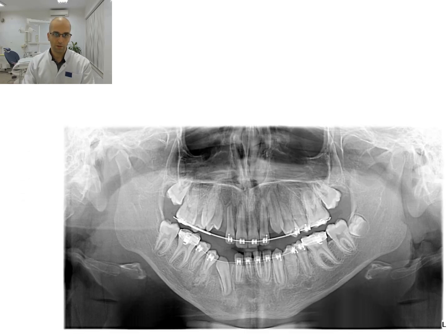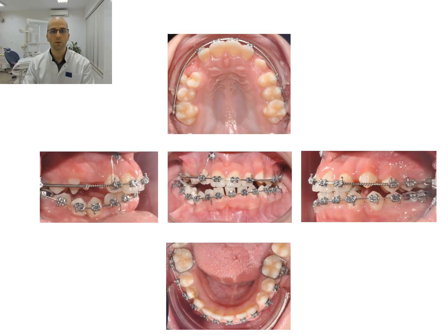The next panoramic X-ray shows the nice healing process of both cysts. An orthodontic mini implant, or TAD, was inserted in the upper arch and ligated to the lateral incisor. I used vertical elastics from the upper right TAD in order to erect the lower canine, and that gave me a chance not to cause a cant in the occlusal plane.